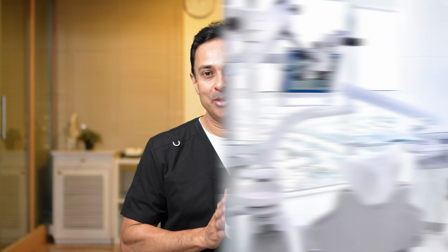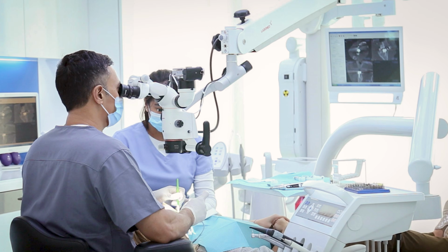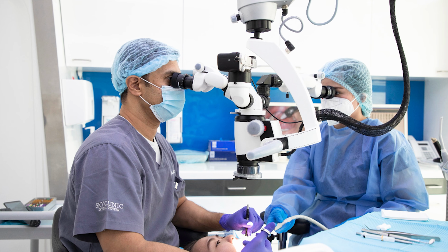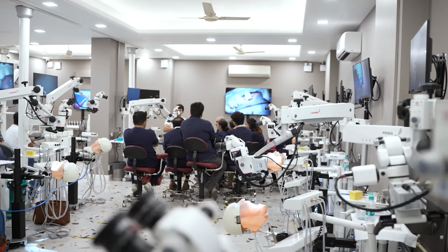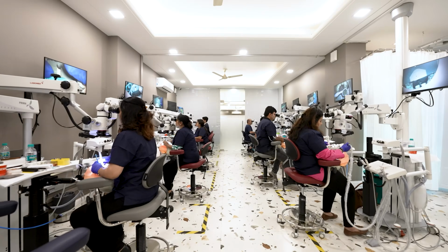I'm going to show you exactly what I do in everyday clinical practice for the last 20 years of my career. And I'm going to show you exactly what we teach our students in our courses on how to work continuously with the surgical microscope, doing everything in endodontics, right from anesthesia to obturation under the microscope without coming out of the microscope.